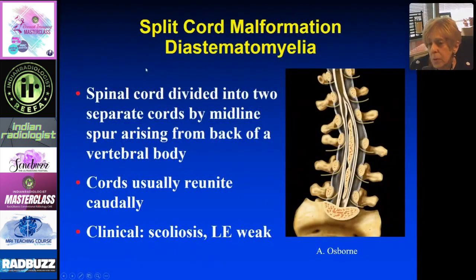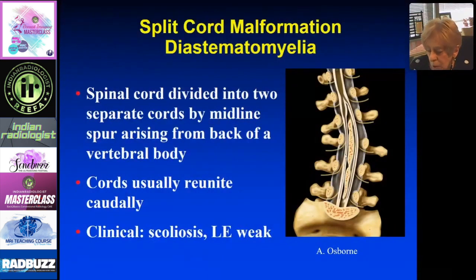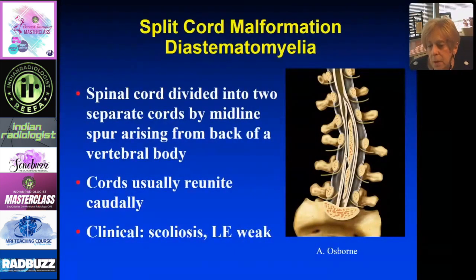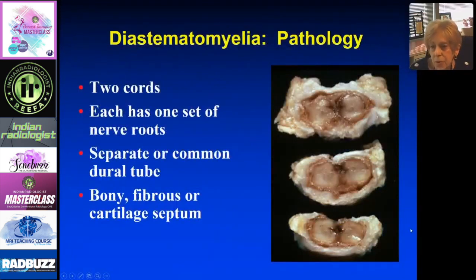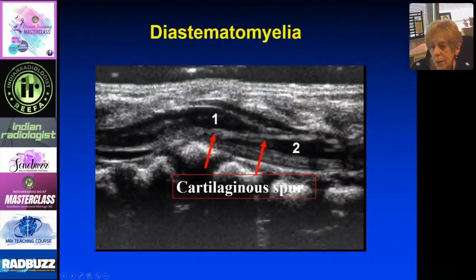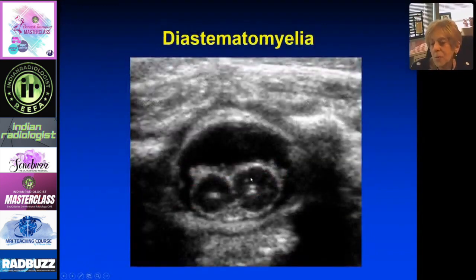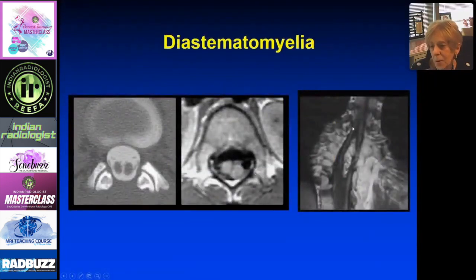The final pathology is diastematomyelia, or split cord malformation. The spinal cord is divided into two by a midline spur arising from the vertebral body. The spur may be cartilaginous or bony. The two cords usually reunite at a lower level. Clinically, patients can have scoliosis and lower extremity weakness. On ultrasound, you see two cords, each with its own nerve roots and separate dural tubes. The spur appears echogenic. The corresponding MRI confirms the split cord and surrounding anatomy.